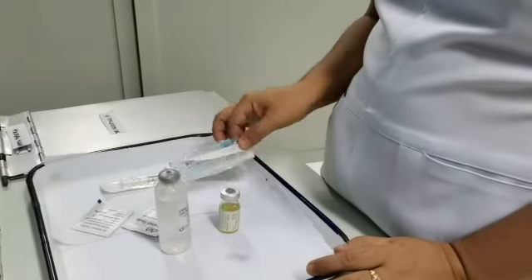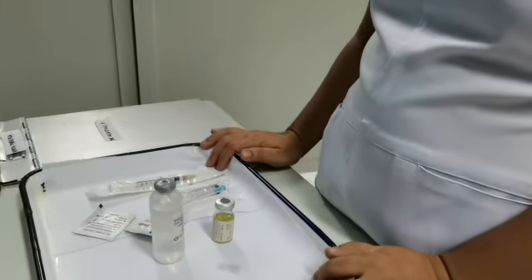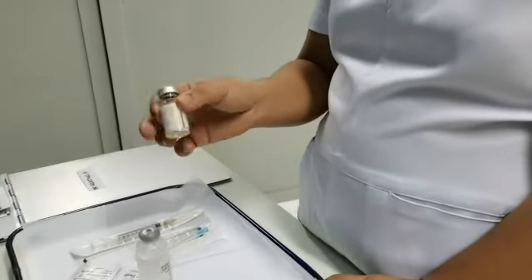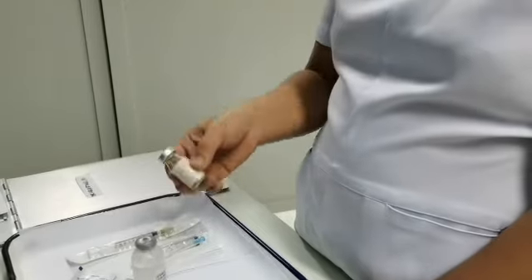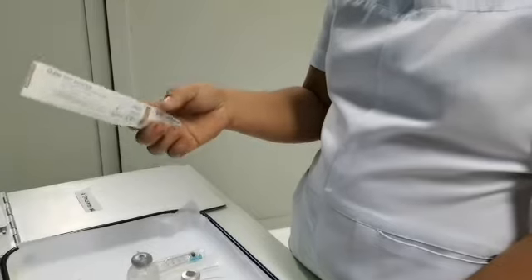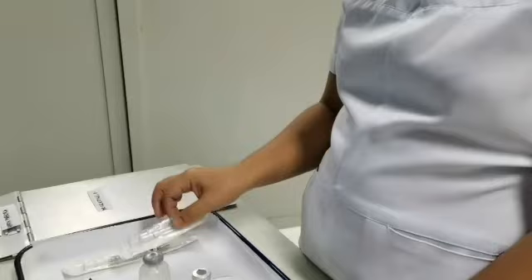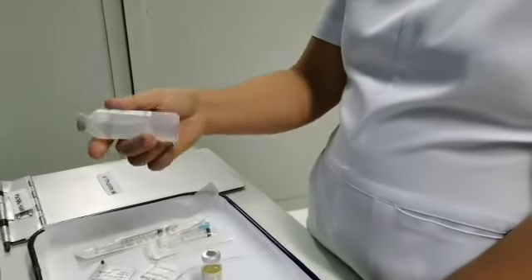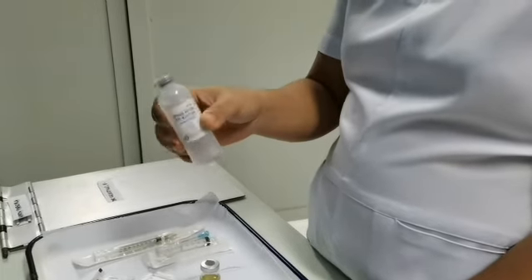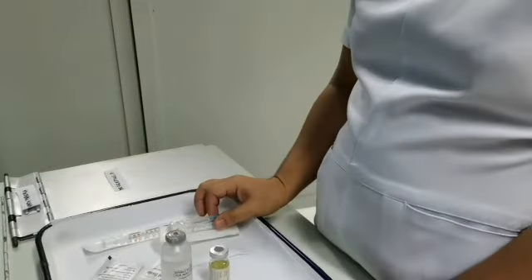This time we are going to teach you how to prepare medications for skin testing. So after diluting the powdered antibiotic, you now prepare your tuberculin syringe or 1 cc syringe, and then your 5 cc or 10 cc syringe. So this is your diluent, this is sterile water for injection, and sometimes we can use plain NSS. At this time we are going to use sterile water for injection.